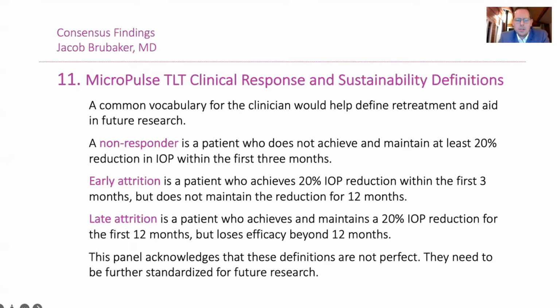In patients who already showed a very good response, a retreatment can certainly be done. And I also have some patients in whom I performed the primary treatment already 4 or 5 years ago, and they received 2 retreatments in the last 5 years. So if they had a very good response and it lasted for 2 years, for example, you have a very good reason to do a retreatment in those patient categories.